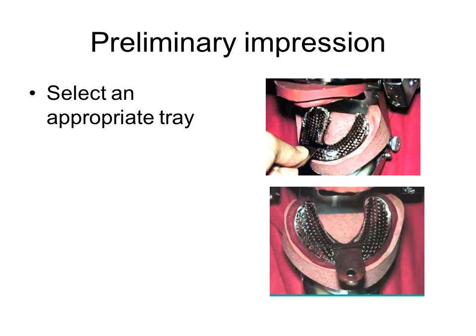Mount your complete denture simulations. The mandibular impression should always be taken first. Select a tray. The flanges ideally do not impinge on any frena. They should be 1/4 inch away from the frenum. The mandibular tray extends over the retromolar pad.